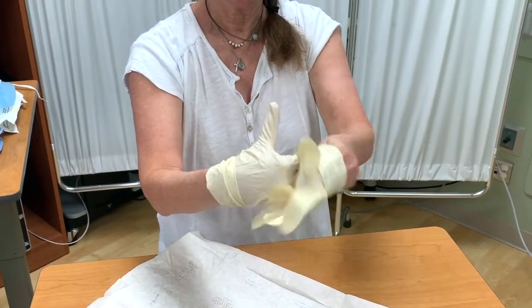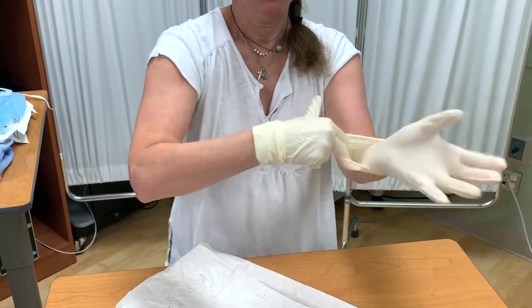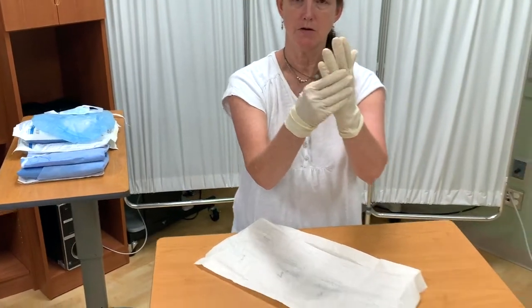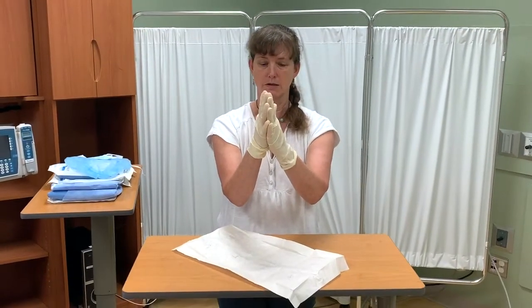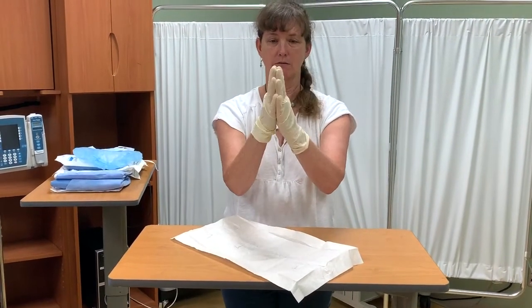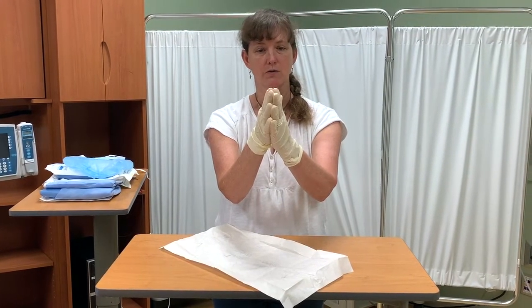This hand's going to go in here, and now I'm ready to go. I can make any adjustments up here that I need to, if I missed a thumb or a finger, to make sure that it's all safe, but I cannot take this sterile piece and touch down here, okay? Now these hands here can touch anything that's sterile, and so I'm ready to insert my Foley.